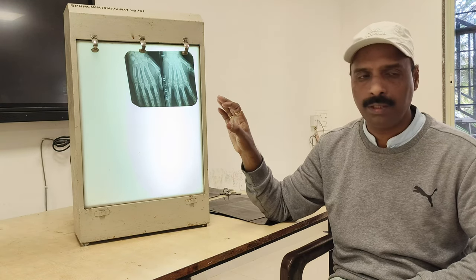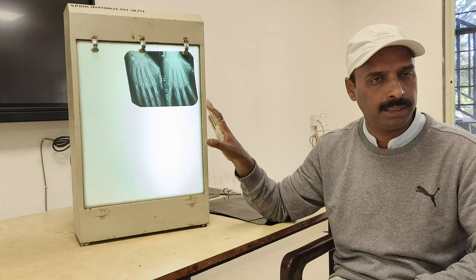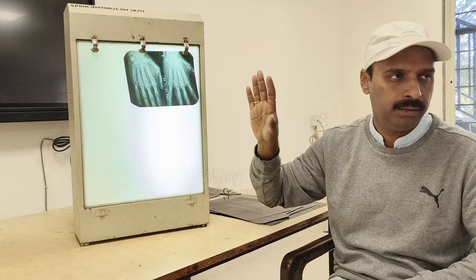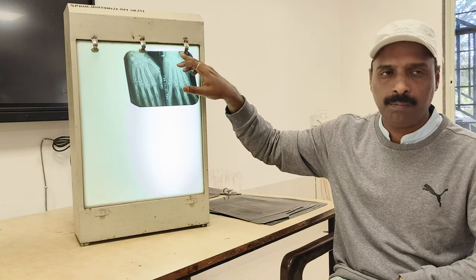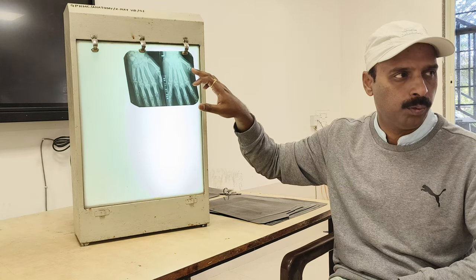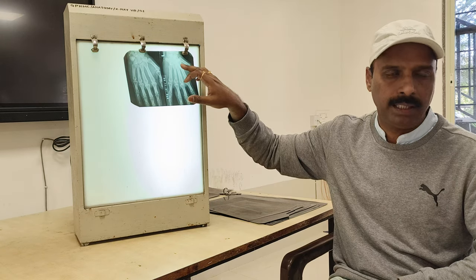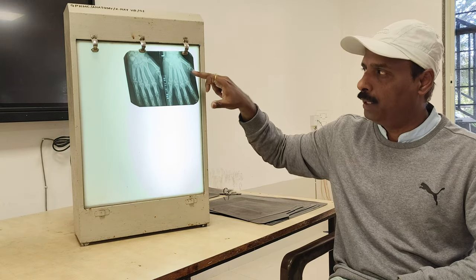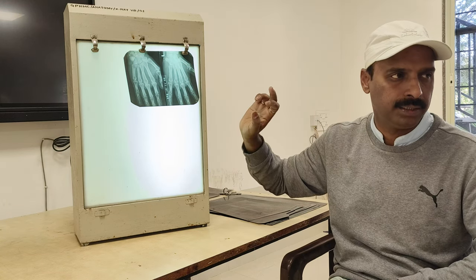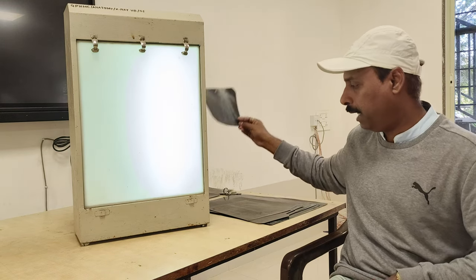So how are you going to read this x-ray? This is a plain x-ray of the hand, which is showing the lower end of the radius and ulna, and the wrist joint. We get all 8 carpal bones: scaphoid, lunate, triquetrum, pisiform, trapezium, trapezoid, capitate and hamate. Then we have the 5 metacarpals, then the phalanges. So this is how you read a plain x-ray of the hand.